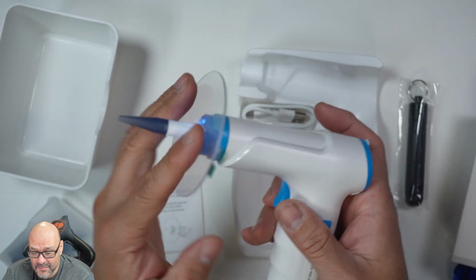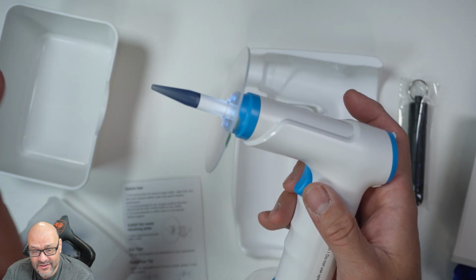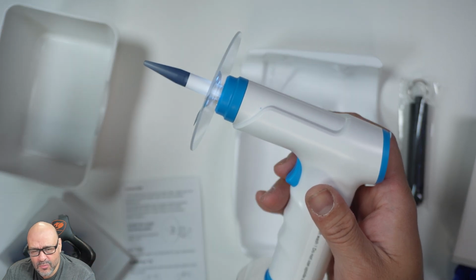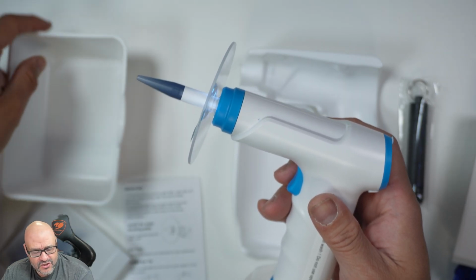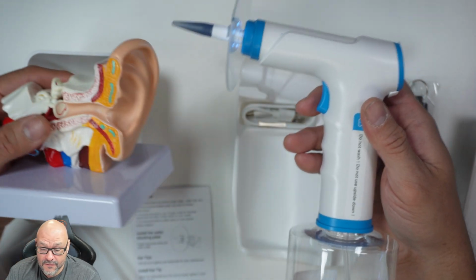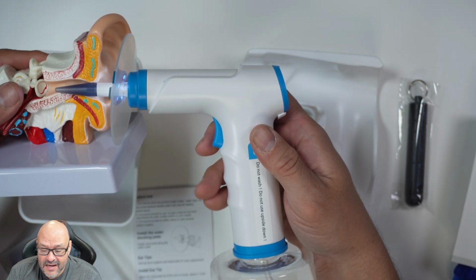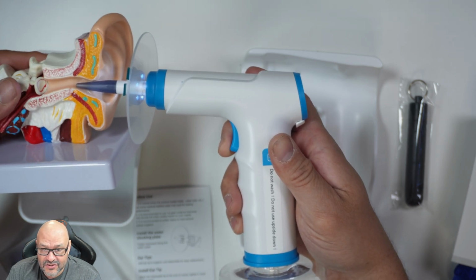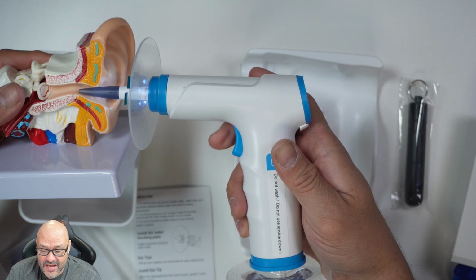You don't have to put this on, but when we reflect back, the water will come in and out, and it just gives you a sensation, small little pressure on the actual water. So we're going to take a look at how it works. So basically this is a demo of an ear. You put it in there and not too deep. You just push it and it throws in water as much as you can.